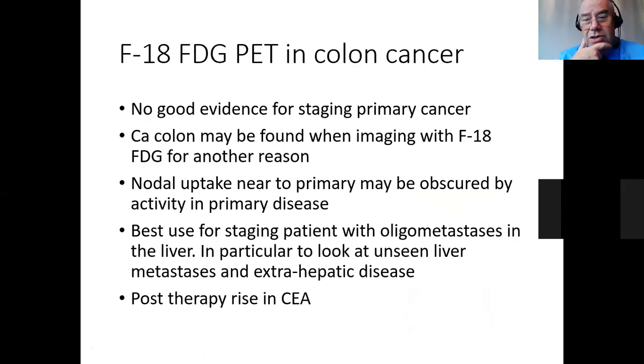Other areas we can use FDG: colon cancer. We've tried multiple times to see whether we can use FDG to stage the primary site, but it's proved that it doesn't seem to be any better than the combination of CT and, in the pelvis, MR. So it's been difficult to justify the additional cost. Some patients we've still done in bulky tumors because we can find some nodal disease. It's just not good for every patient.